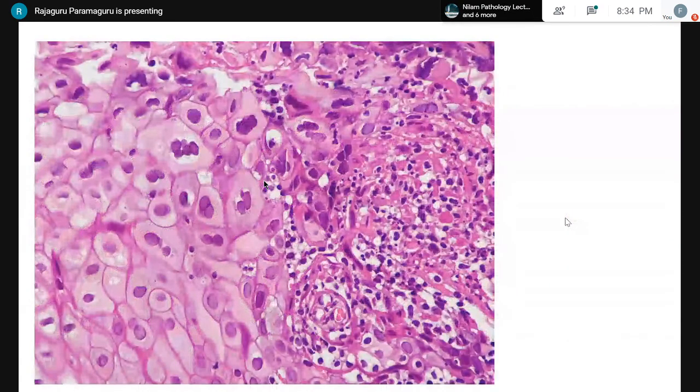This is a case I thought someone would answer, but since there is no response, there is a response from YouTube. Dr. Nabanita Das has said it is CMV. Oh, great.